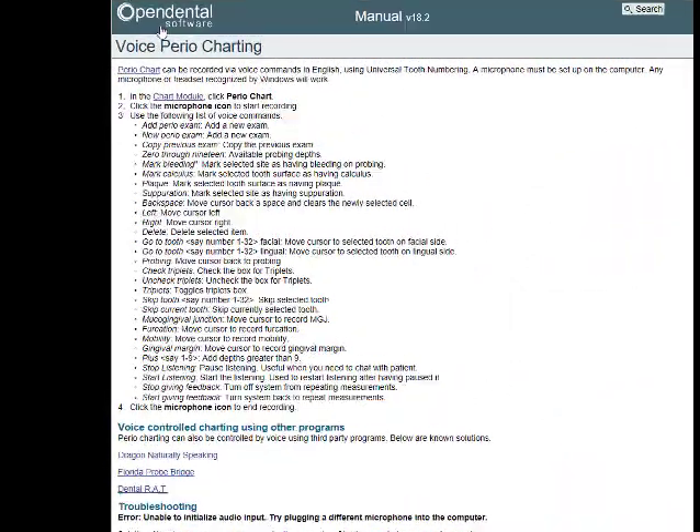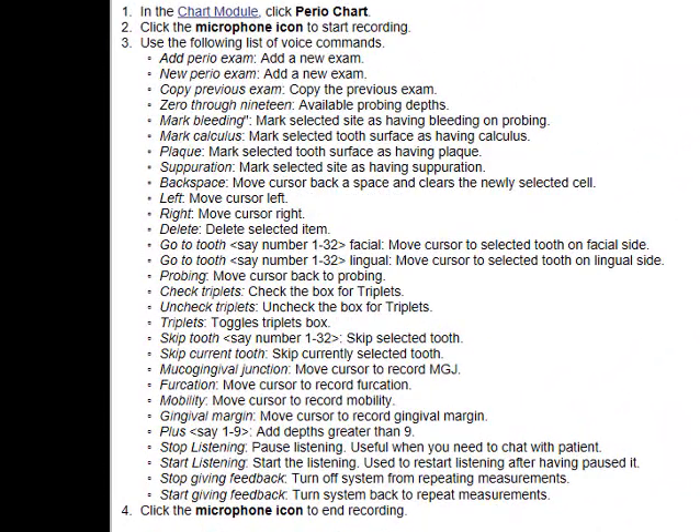If you search on the Open Dental support help page for perio charting and voice perio charting, you'll see a whole bunch of commands that you can use with your voice — stop listening, start listening, move left, move right — lots and lots of voice-actuated commands, as well as the actual pocket markings, which I'm going to show you in just a minute.